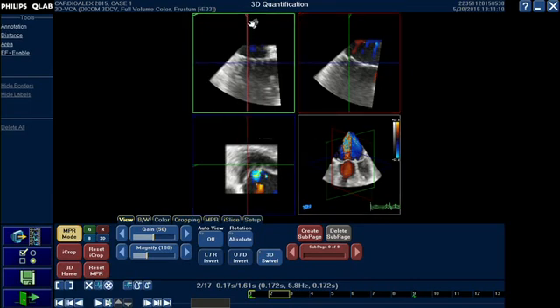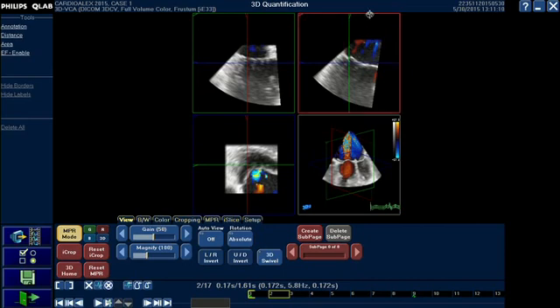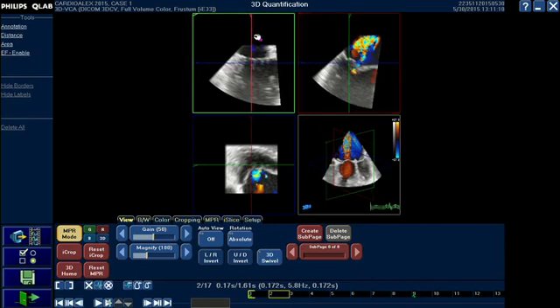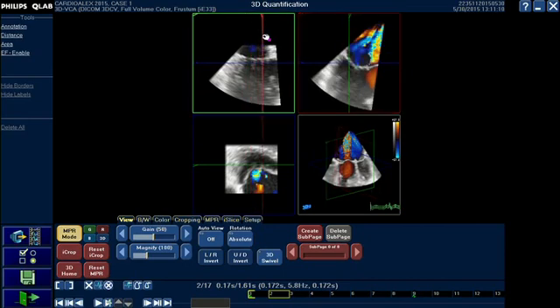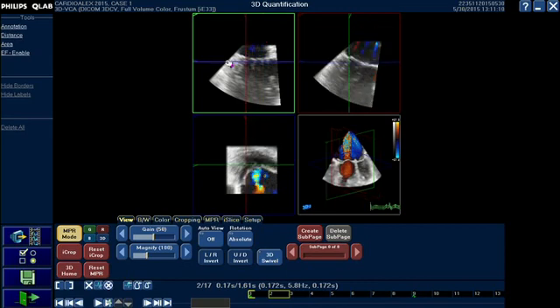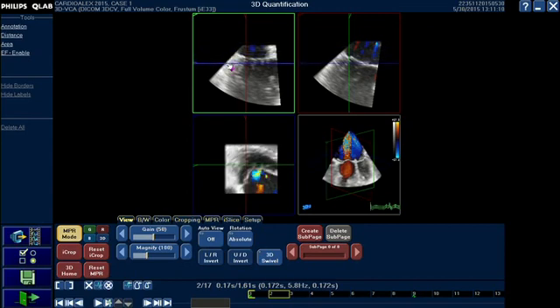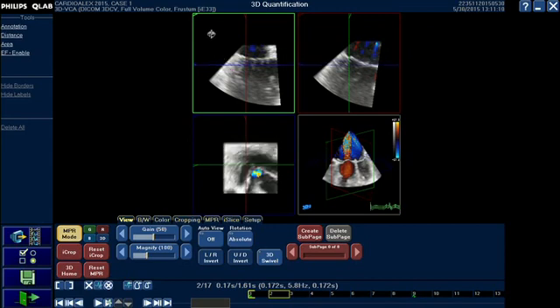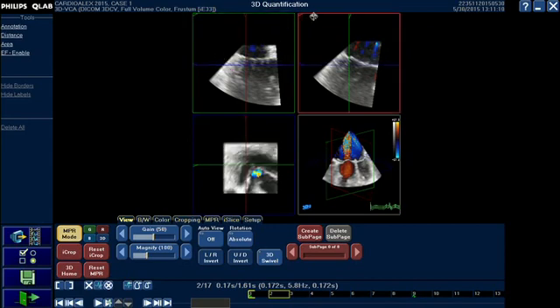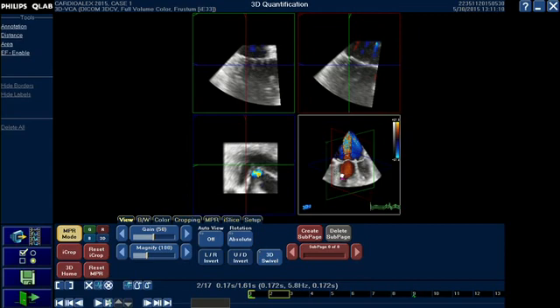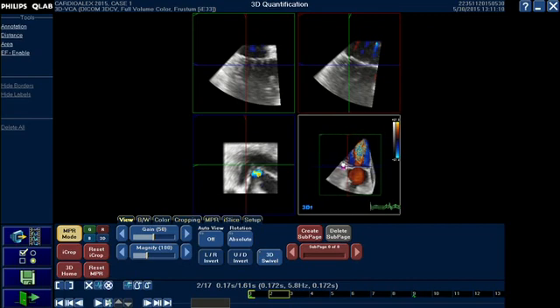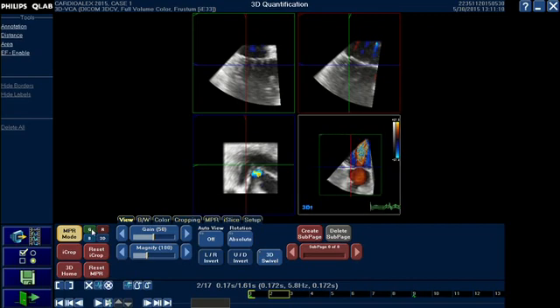The green box has a red line representing the red box, so if I move the red line, the image in the red box will change. It also has a blue line — if I change its position, the image in the blue frame will change. So we have the green, red, blue, and the 3D box which shows all the planes we are cutting with. We also have corresponding buttons for green, red, blue, and the 3D box.